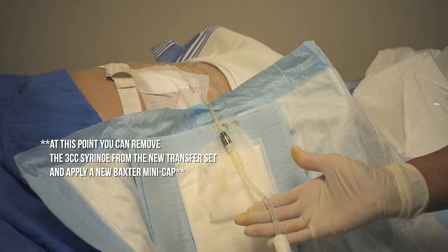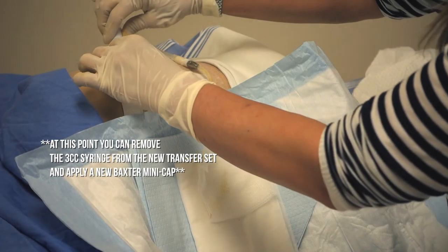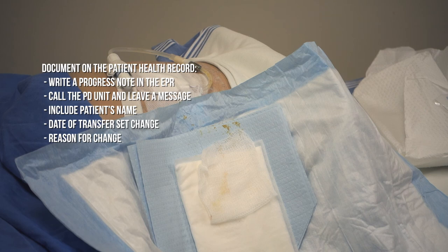You now have a new transfer set. Be sure to anchor your transfer set securely so it is not being tugged on or pulled on. Ensure that you document the date of the transfer set change in the patient health record and cardex, and also document the reason for change.